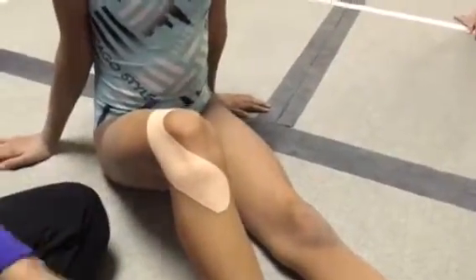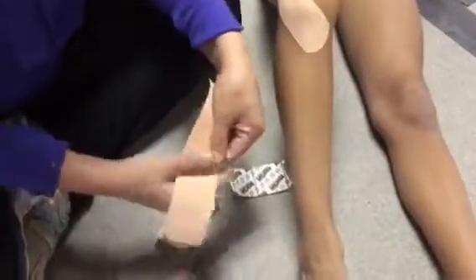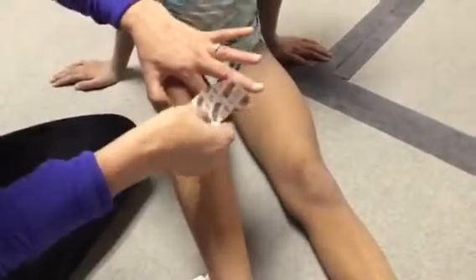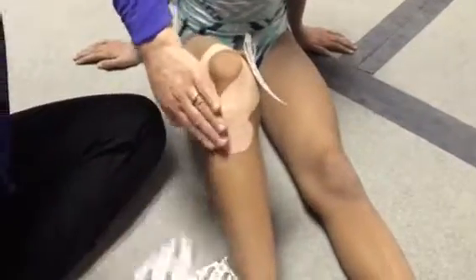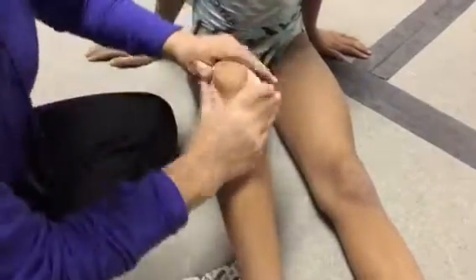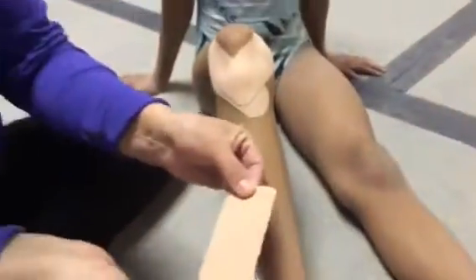I'm going to do the same thing on the other side — rip it, put it right next to her kneecap, roll it over that bump at the tibial tubercle, and then around here. So these two pieces are crossing. Rub the tape to activate the adhesive.